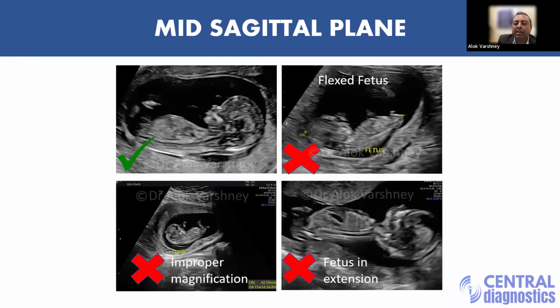This is fine, but make sure that you do not have a fetus who is flexed. So here, notice that there is no fluid between the chin and the chest. So that is why the baby is flexed. So you will get a measurement on the lower side.